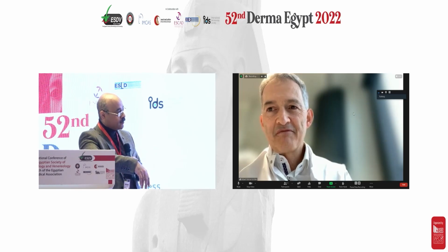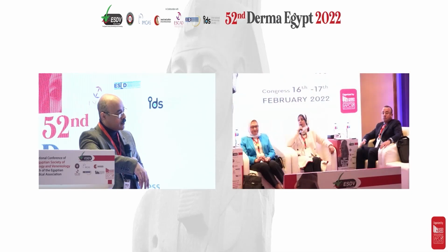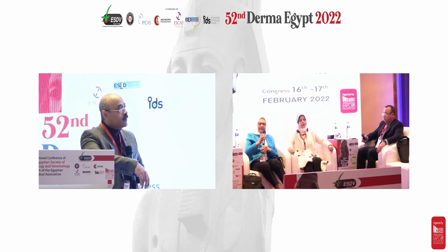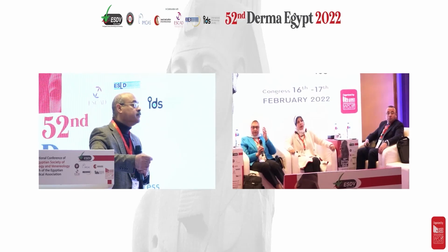For me, I'd like to use the erbium glass laser. It gives a marvelous effect and it is non-invasive, safe in dark skin. So I recommend using it. Fractional laser. Okay. Please, Dr. Ashraf.